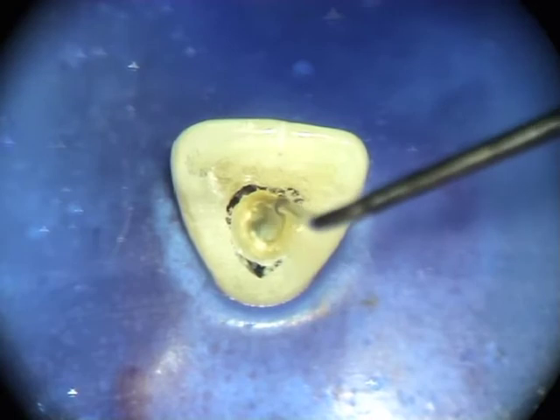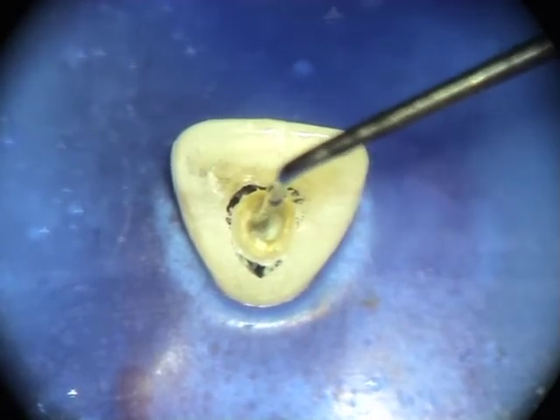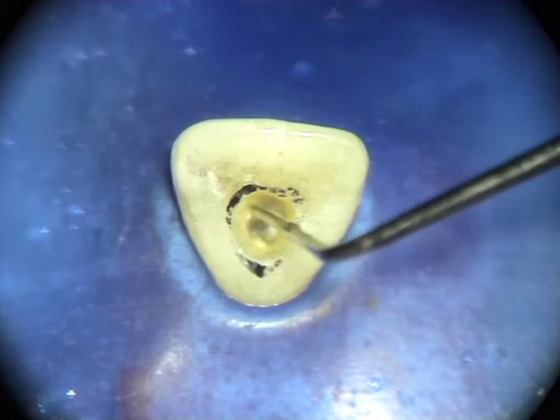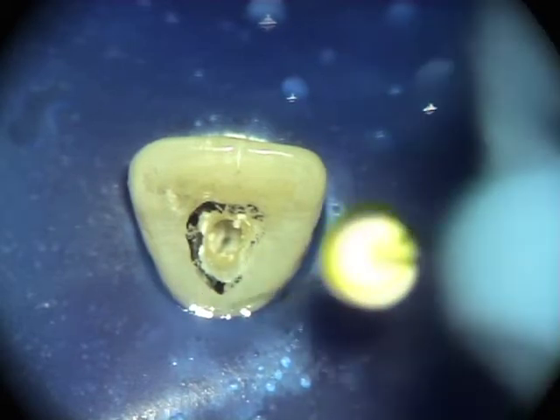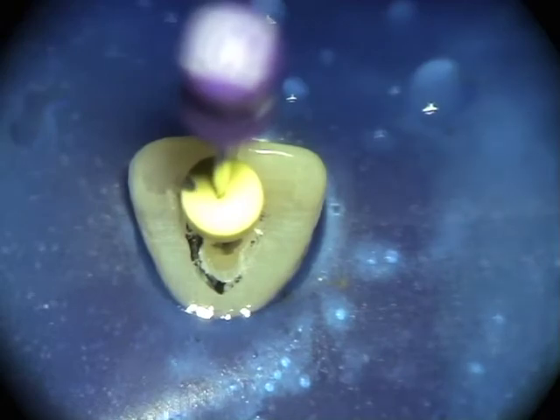After initial preparation of the access cavity, it is sometimes possible to detect rough areas within the cavity. These will be removed in the next stage. The entry angle into the root canal can be assessed using a number 10K file. It is also important to ensure that the canal is accessible from the access cavity.